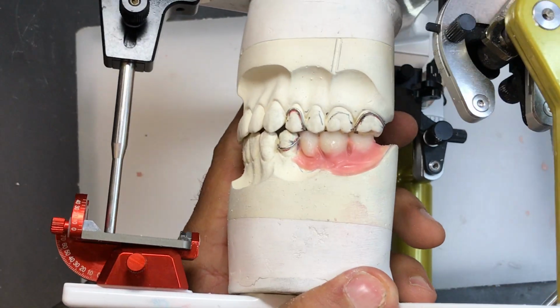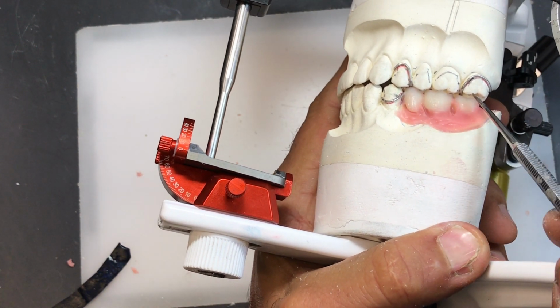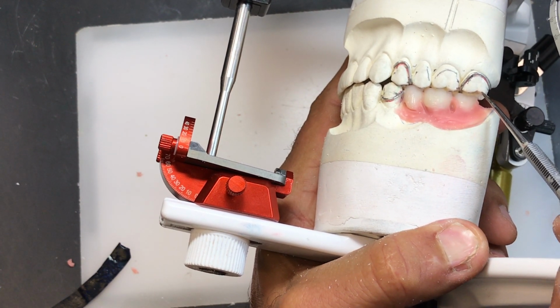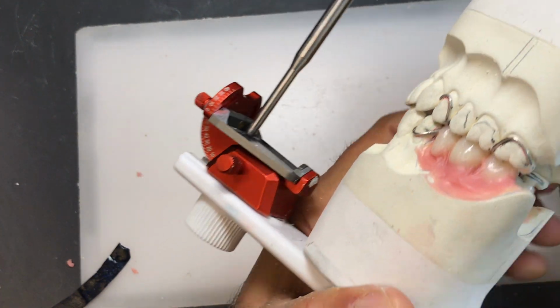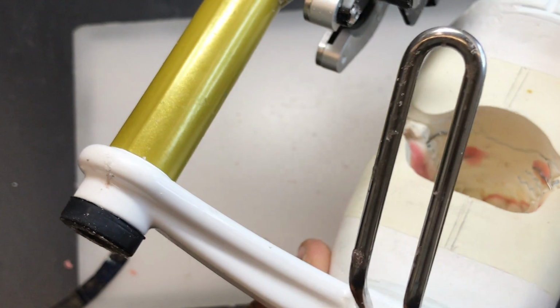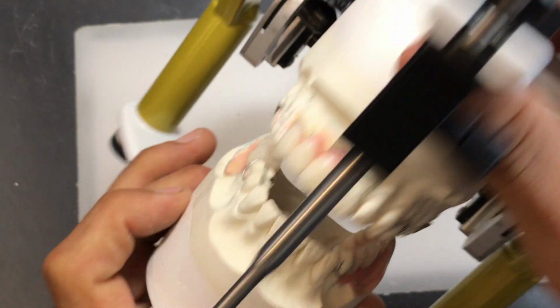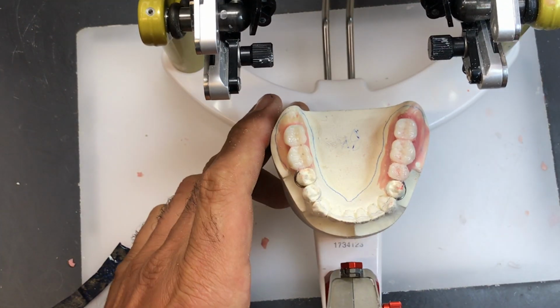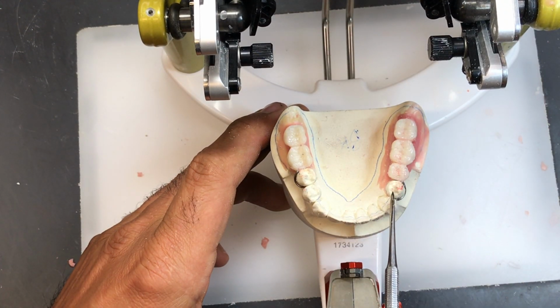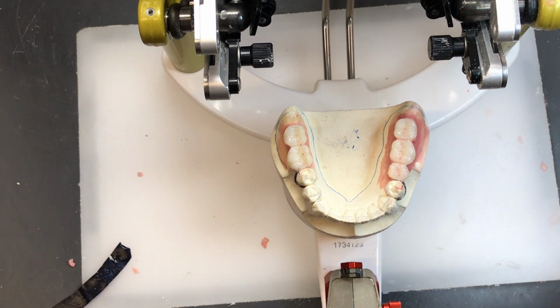I'm not going to get perfect buccal overjet here because this tooth is so far out of position. That's usually the case with natural teeth. But I got a nice centric intercuspation for the most part. My central fossas are lining up here as well as here. Everything looks symmetrical.